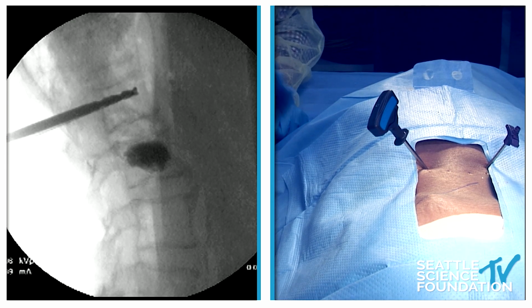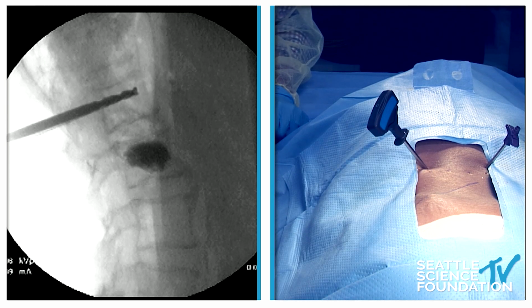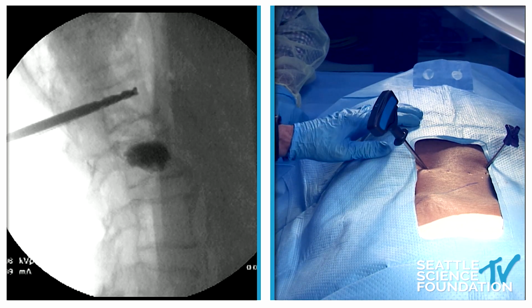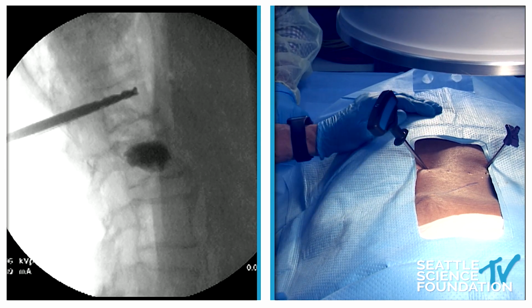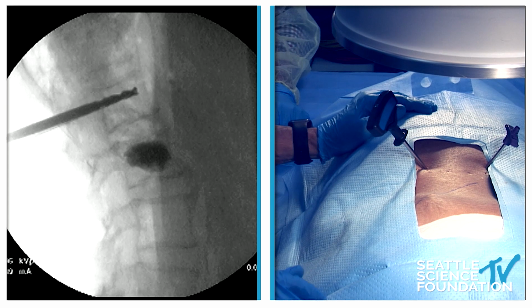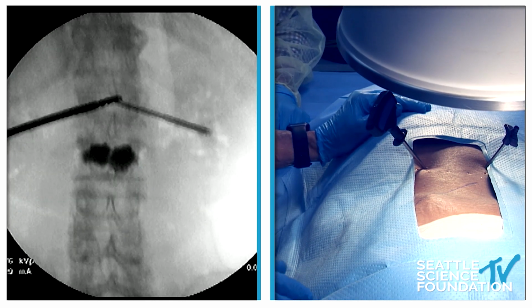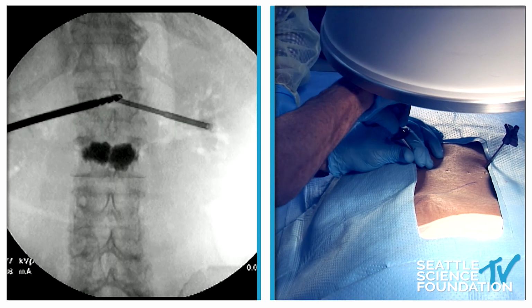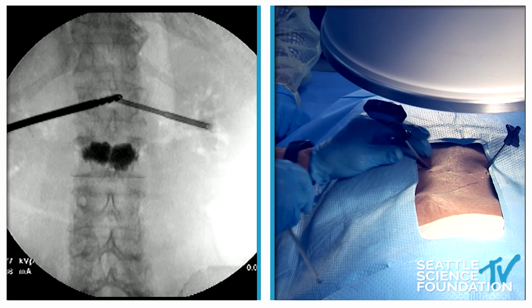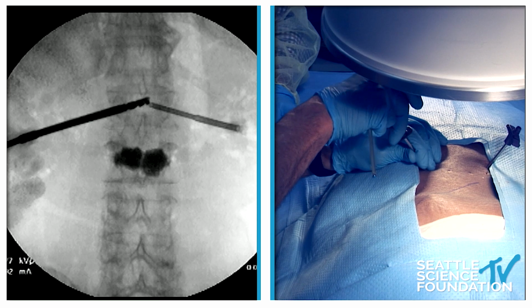At this point in time, I want to take an AP shot, and we're going to check our medial lateral dimension to make sure we're okay there. And then once this is the case, we can have a template to clear out any bone shards, and we're at least to midline. We're slightly across midline. So what I'm going to do is back it up just a smidge. So we'll be in really good position.